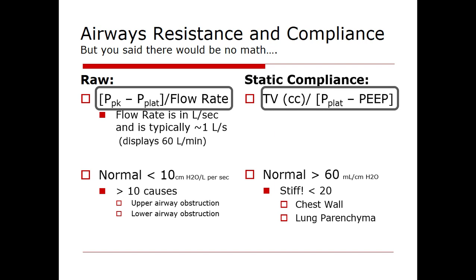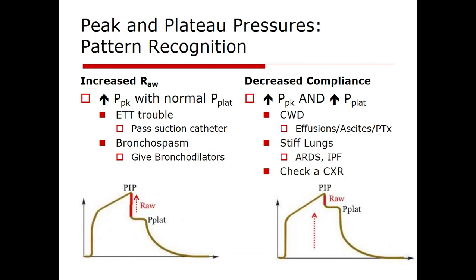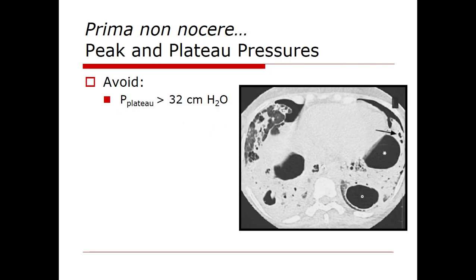So, this is spending more time on an ICU-specific topic than I probably should have. But when the time comes and you're in the ICU, peak and plateau pressures, calculating resistance and compliance are things you're going to do every day. Just another slide describing that.